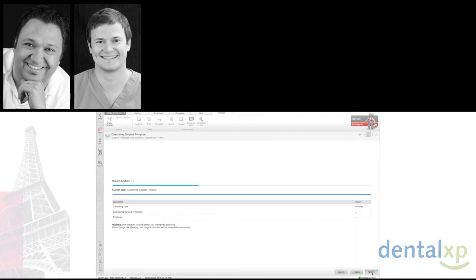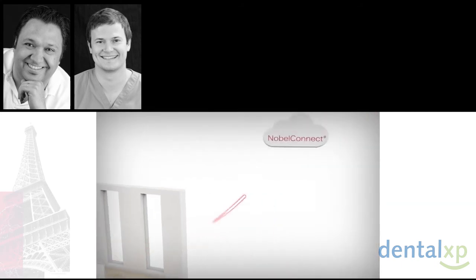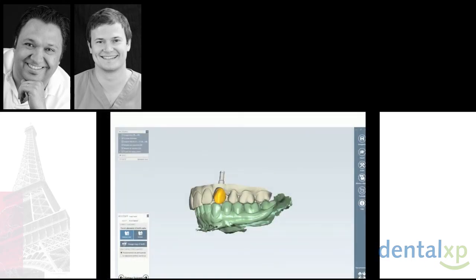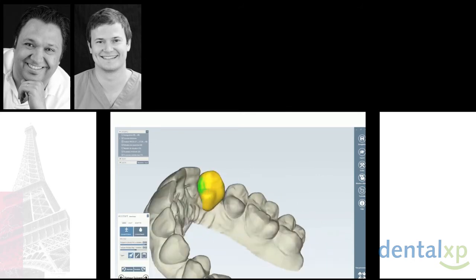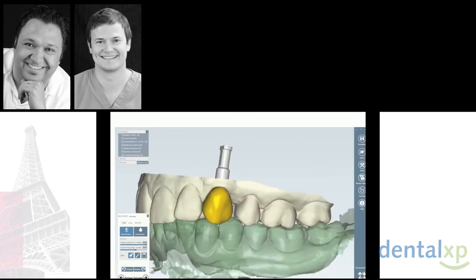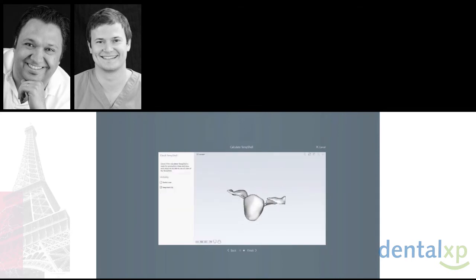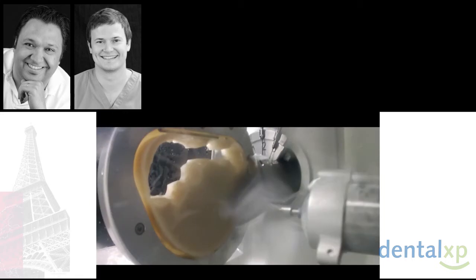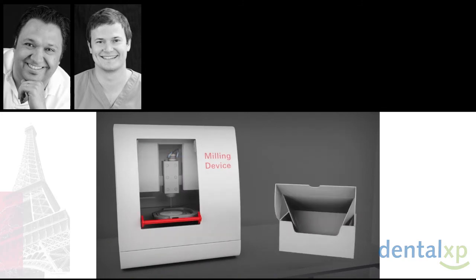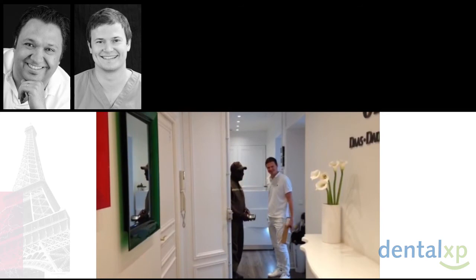And here we are at this stage in the software. What we can do at this stage when we have this surgical guide is jump to another software called Nobel Design. In Nobel Design, we are able to modify further the smart setup, the wax up, and modify it very precisely to build exactly the future temporary crown that we want for this patient. We are going to add some wings on the sides, and those wings are going to help us stabilize the temp shell on the adjacent teeth in the perfect position. And then we get everything delivered in the office and we are ready for the surgery.